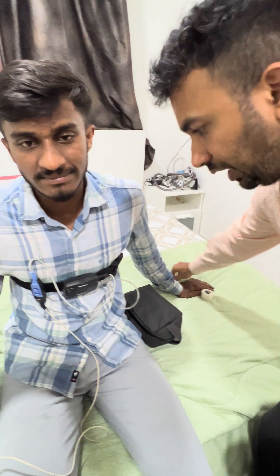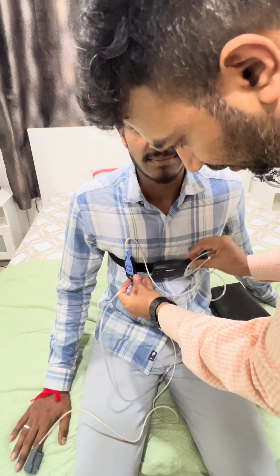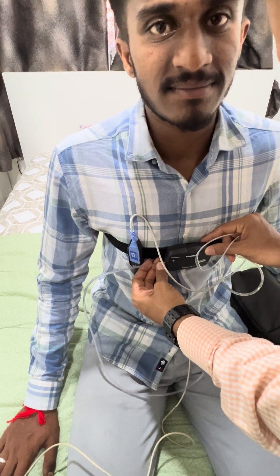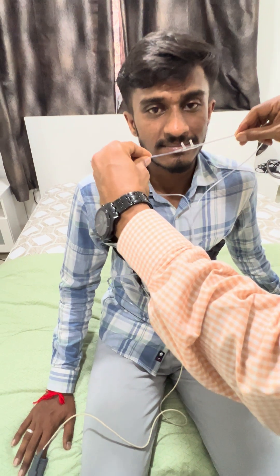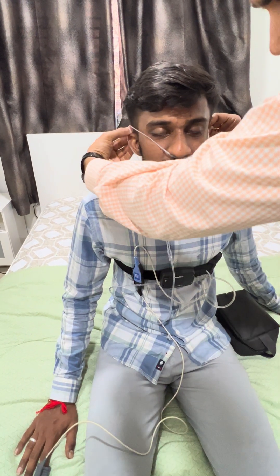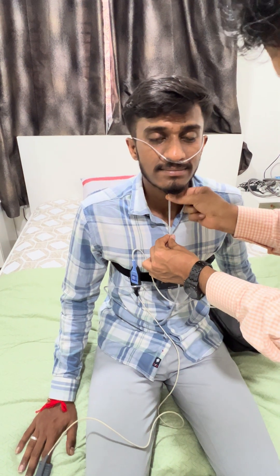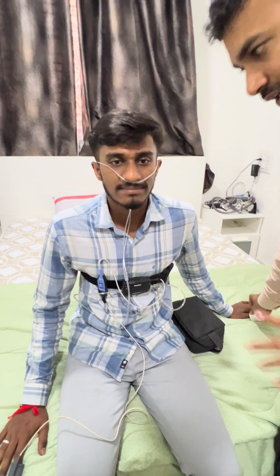Now take the nasal cannula, which records snoring and nasal pressure throughout the night. Lock it and place it into the nostrils. Initially there will be a little irritation but later it will become comfortable — you need to bear that irritation initially. Then pull it up and make it tight.